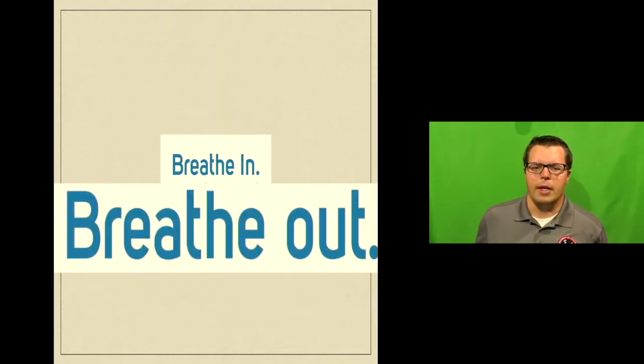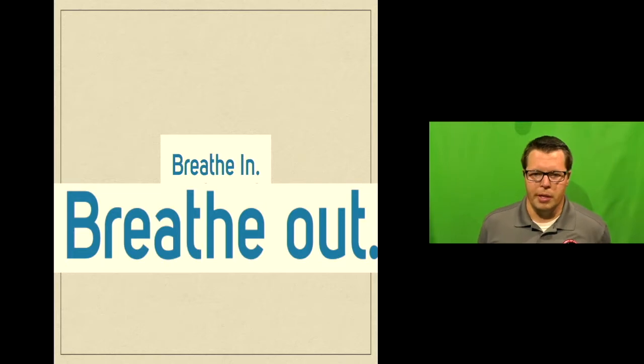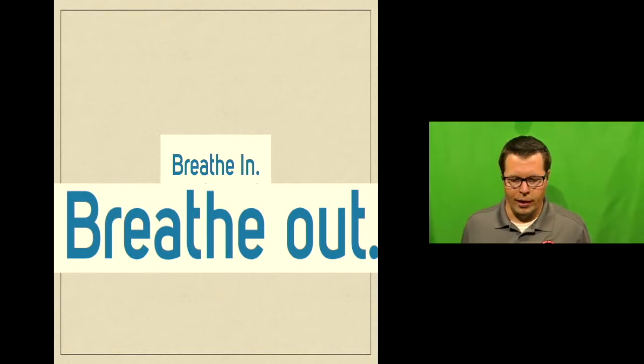So we need to give them a little bit of time to breathe in, a quick breath in, but we need to give these folks a long time to breathe out. Lots and lots of time to do that, because if you try to force more air in on top of the air that's already there, eventually you're going to overpressurize and either you're not going to be able to ventilate or you're going to cause a pneumothorax or at least get a pressure alarm on the vent and the vent will stop working.